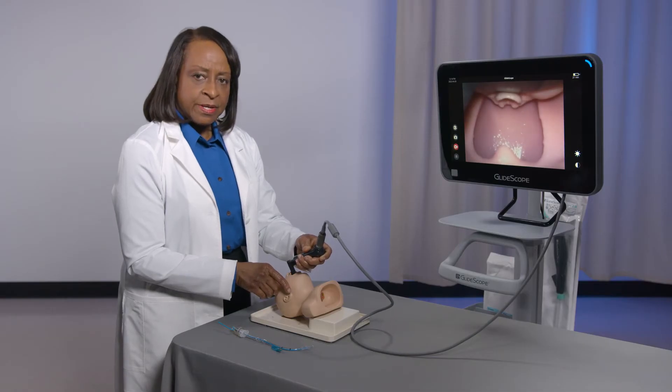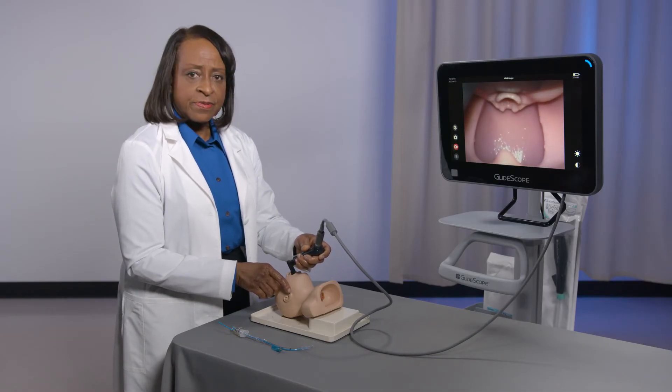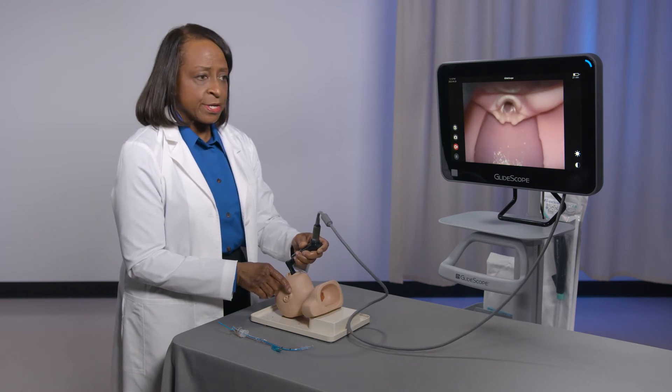Optionally, you can also position the tip of the blade in the vallecula and use a small lift to expose the glottic opening. This may be useful for a stubby epiglottis that is difficult to trap under the blade tip.